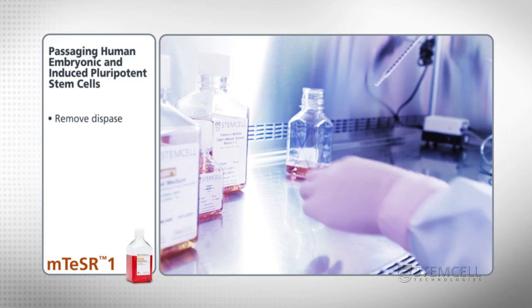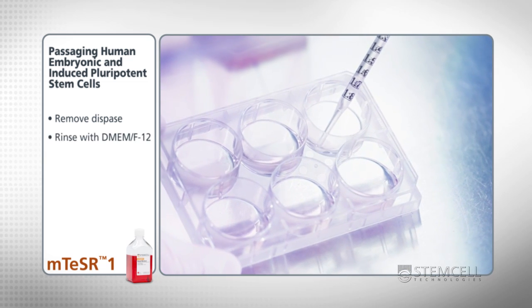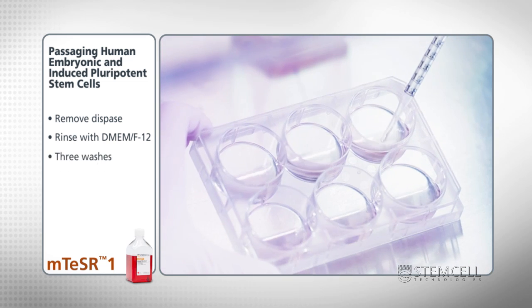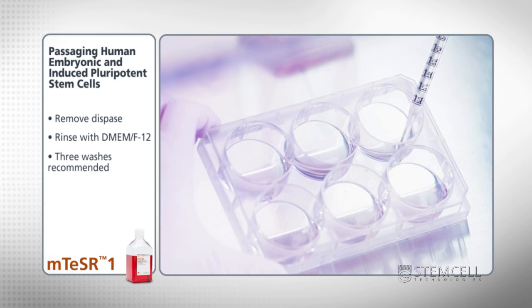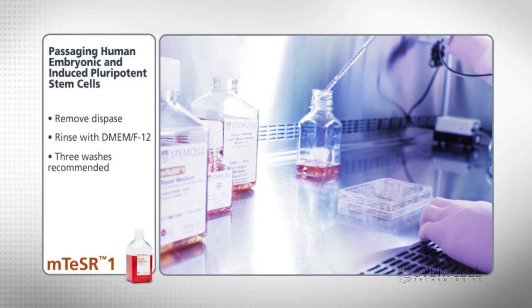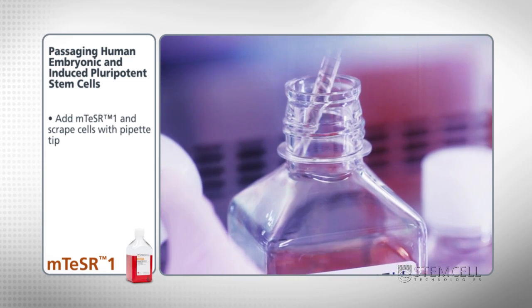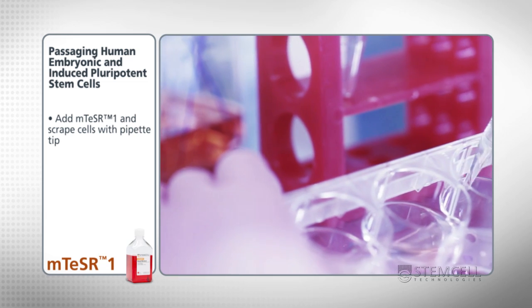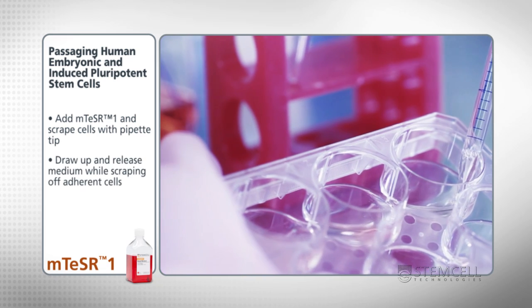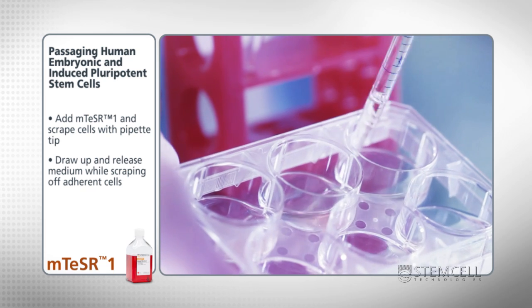Remove the dispase and gently rinse each well with DMEM/F12 to stop the dissociation process. It will take a few washes to ensure that all traces of dispase are removed — three or more washes are recommended. If the enzyme is not thoroughly rinsed from the cells, there may be difficulty with adhesion when plating in a new dish. Next, add mTeSR1 and scrape the cells off with a pipette tip. This process will mechanically break up the colonies into smaller clumps.